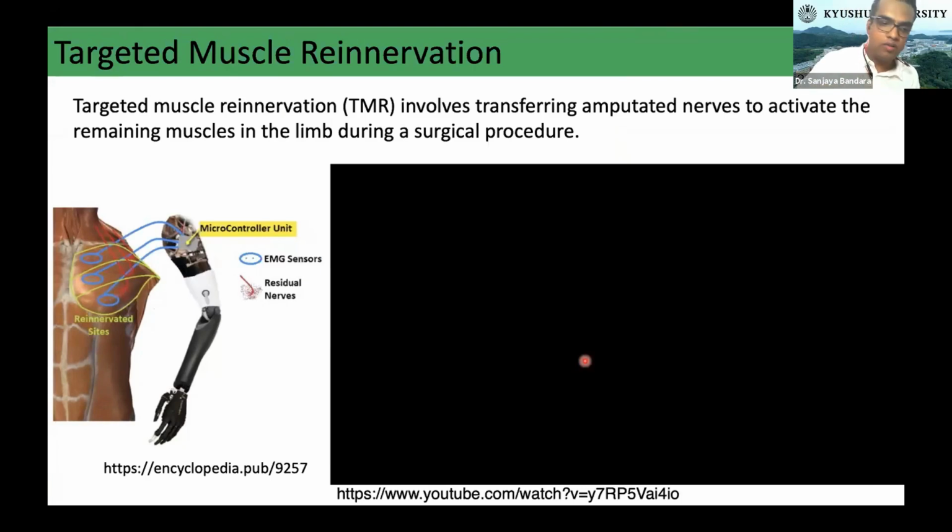As a solution, for example, these finger motions are controlled at some part of muscles around here. As I mentioned earlier, all these signals come through the brain, through the hand to the proximal area of the forearm. But if some person has lost his limb here, his neurons carrying these signals will be stopped here.